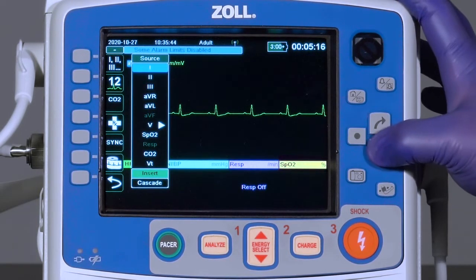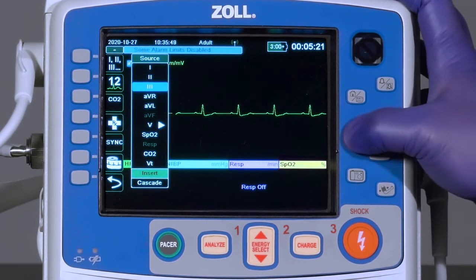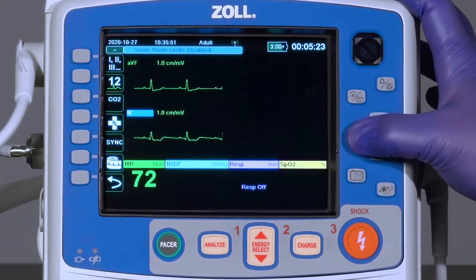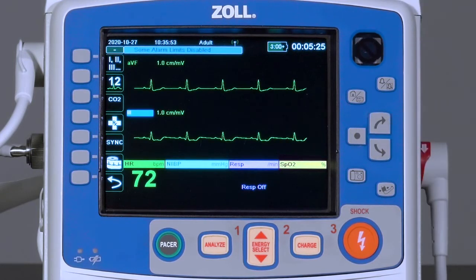Then select from the available lead views to insert, such as lead 3, choose it, and press the select button again.